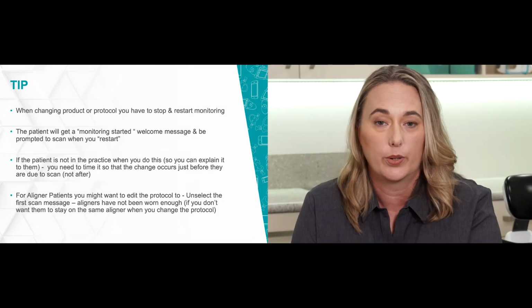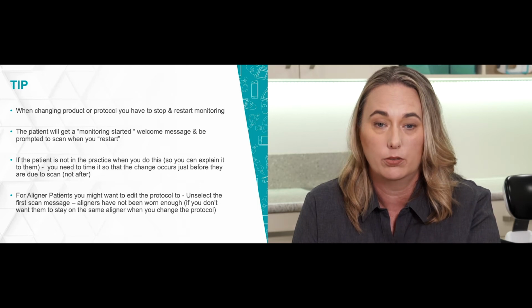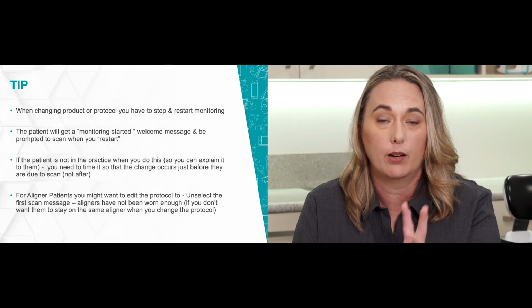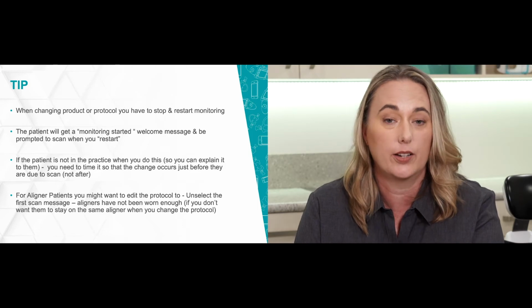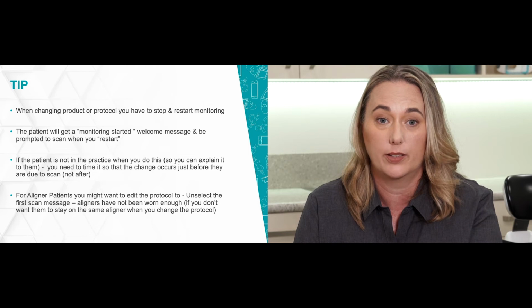So just a couple of quick tips before we get onto this. When you're changing a product or a protocol, you have to stop and start monitoring. So the patient will get a monitoring started message and be prompted to scan when you restart. Now that message you can't change, it comes from dental monitoring and it varies from braces to aligners.